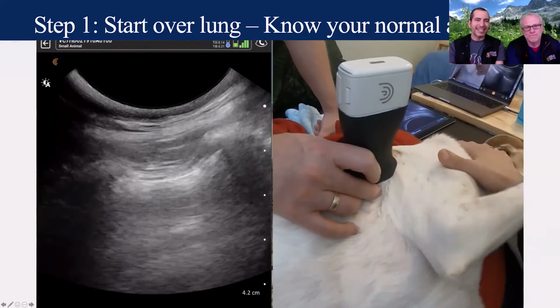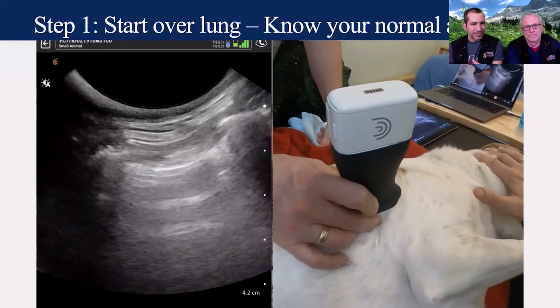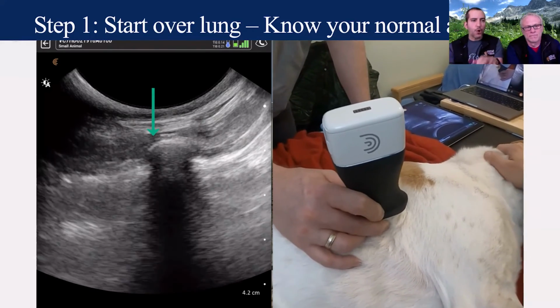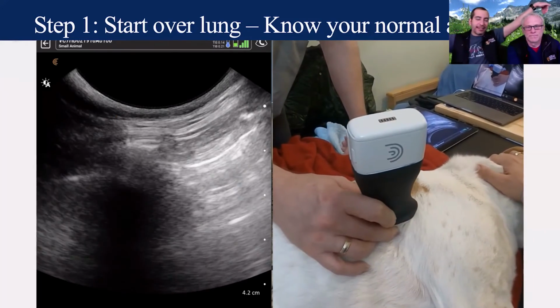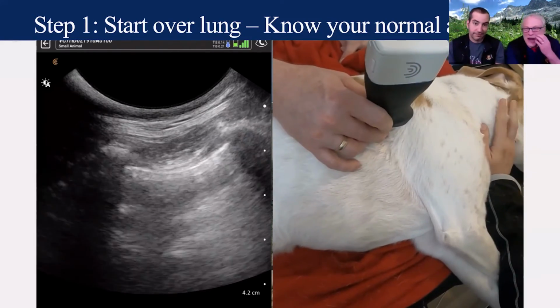Well, Dr. Boysen, we can sit on top of a rib like we're doing right there, and that also changes the angle of inclination on either side, and it helps you see that lung sliding. You can also fan the probe or change the gain, Dr. Boysen. So here we are. We like to call this the dead bat sign because the bat, instead of being like this, is upside down, so you see its body hanging upwards, Dr. Boysen. All right, good imagination.